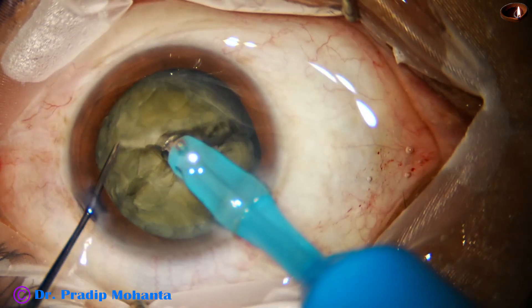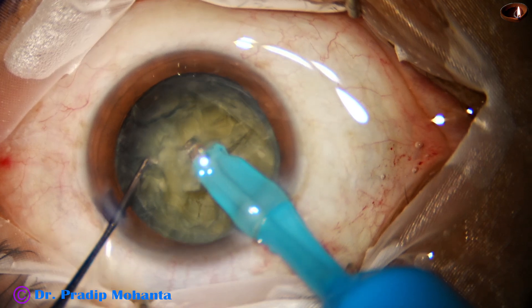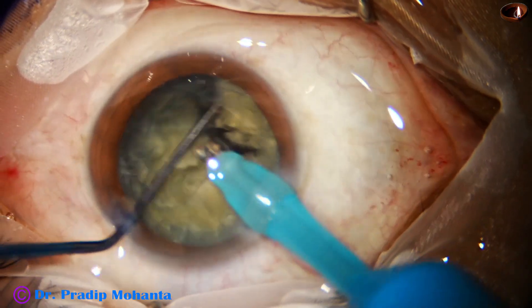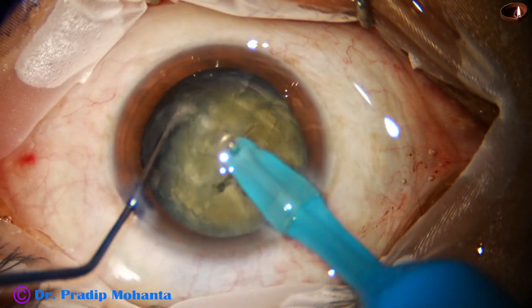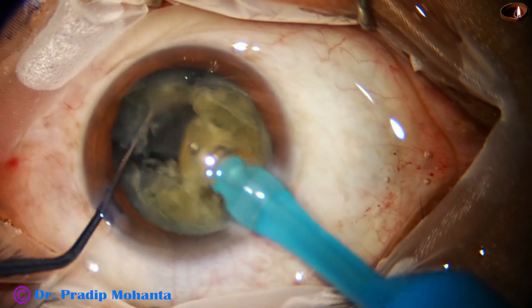Now this hemi-nucleus is held with vacuum and it is chopped into two fragments. Then I come to the other hemi-nucleus and chop it also into two pieces. So we have got four pieces.